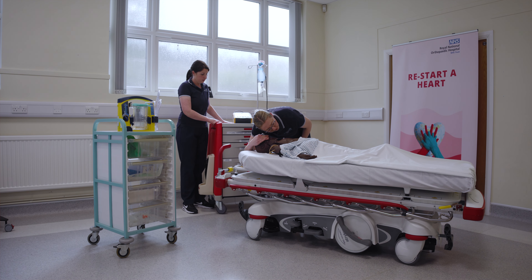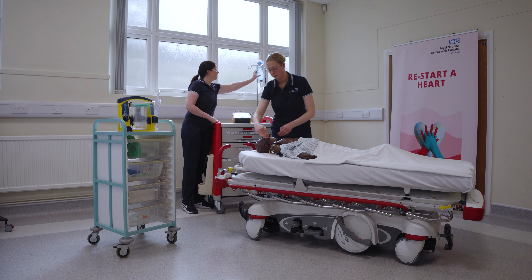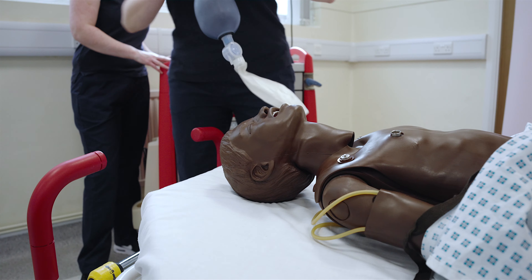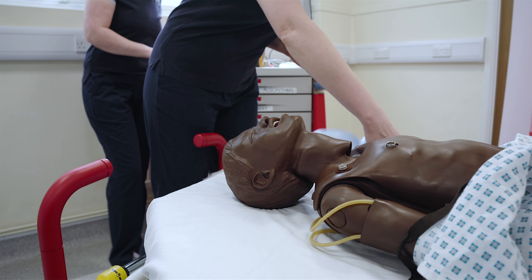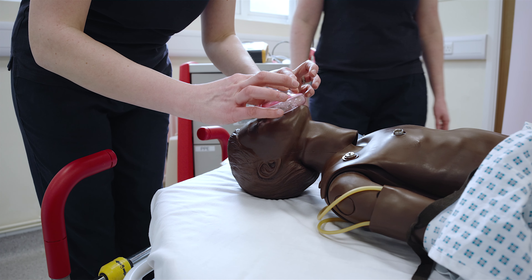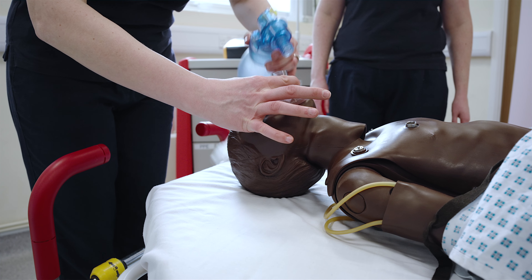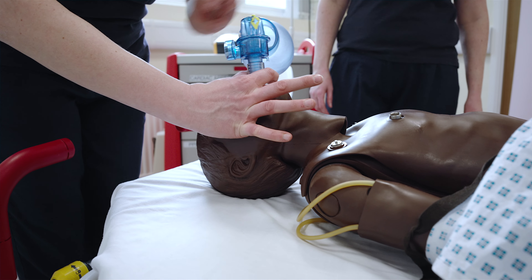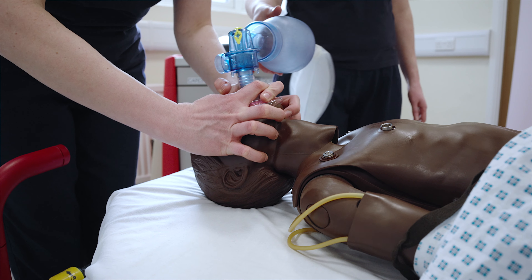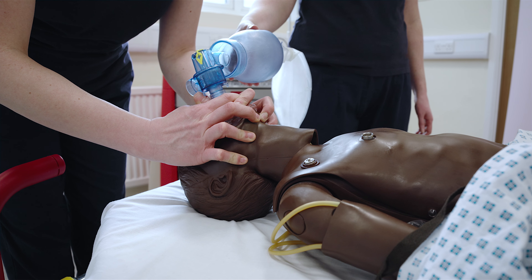If there are no signs of life, you need to give five rescue breaths via bag valve mask ventilation. Get the mask and measure it on the face. Bring the face to the mask and ask the other rescuer to squeeze the bag using one hand for five breaths. We are looking for bilateral and equal chest rise on each breath.